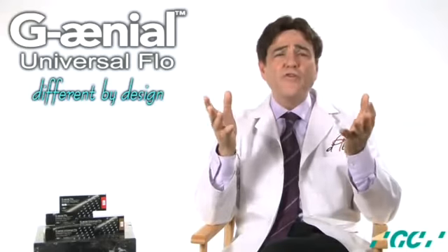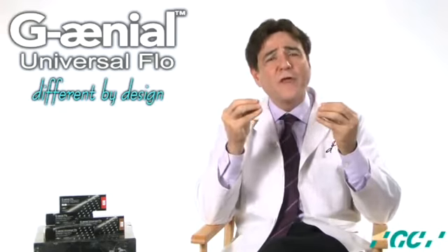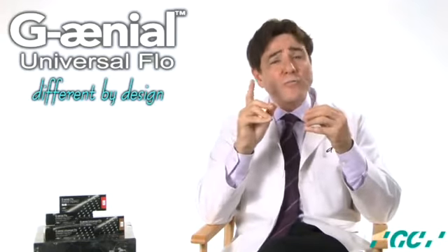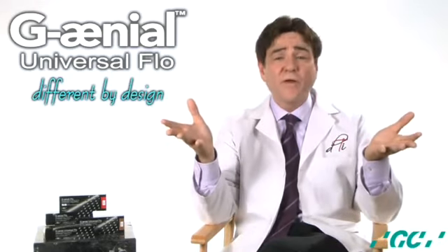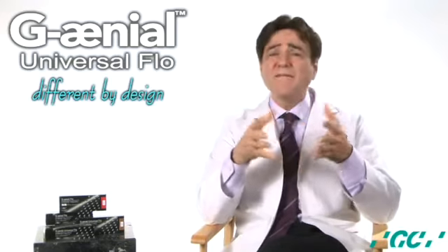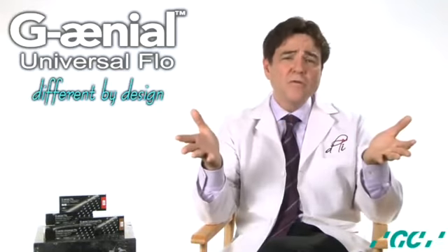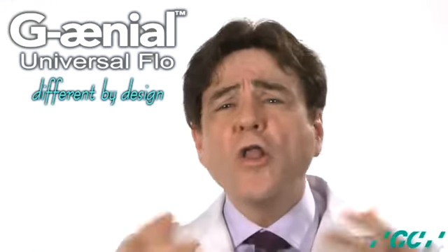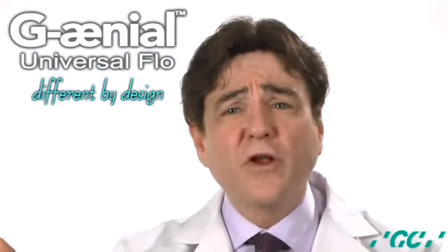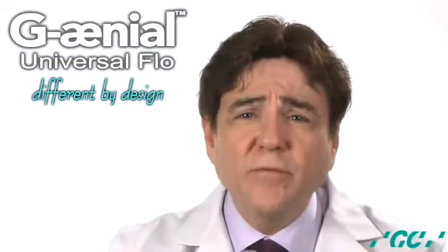Although this biomaterial, G-aenial Universal Flo, has so many potential uses, the selection of the proper material for any particular clinical situation requires many consideration factors, including the biologic, physical, and mechanical properties of the material, the placement technique, cavity configuration, anticipated margin placement, curing light intensity, tooth anatomy and position, occlusion, patient's oral habits, and ability to isolate the operative field. All of these factors have the potential to influence the clinical behavior and material performance, and each should be considered prior to restorative treatment.